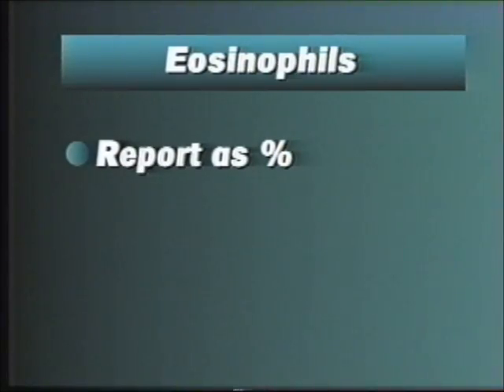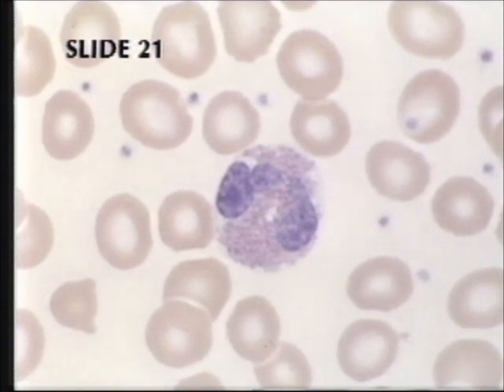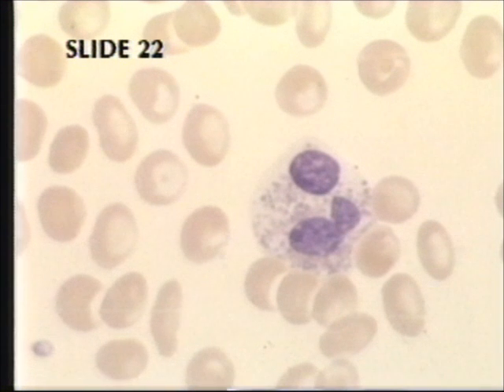Eosinophils are distinct and easily identified because of their large, marble-like red granules. Unless there is moisture in your stain, then the eosinophils may have a washed-out look like this, or worse, and may be difficult for the novice to identify.